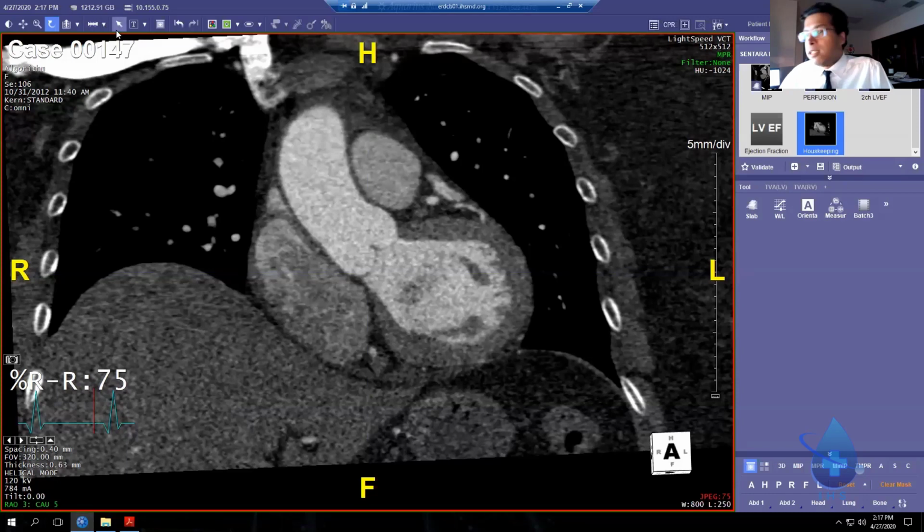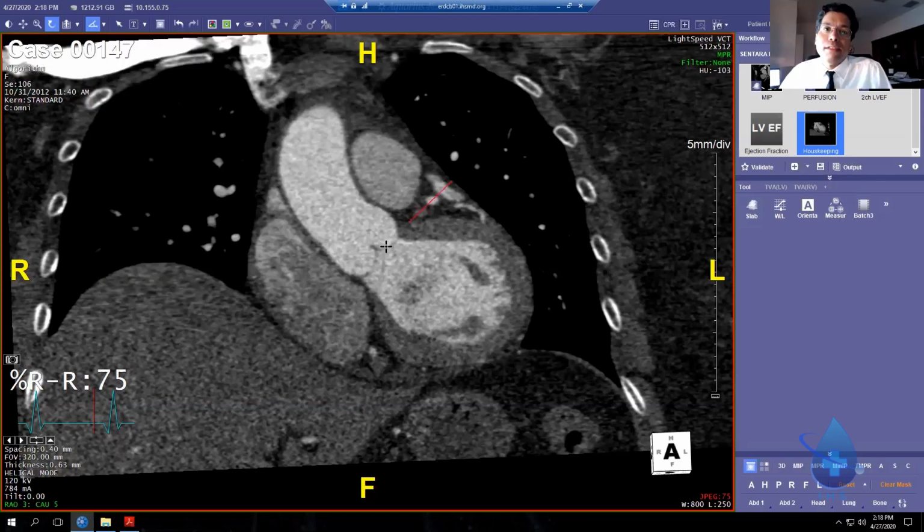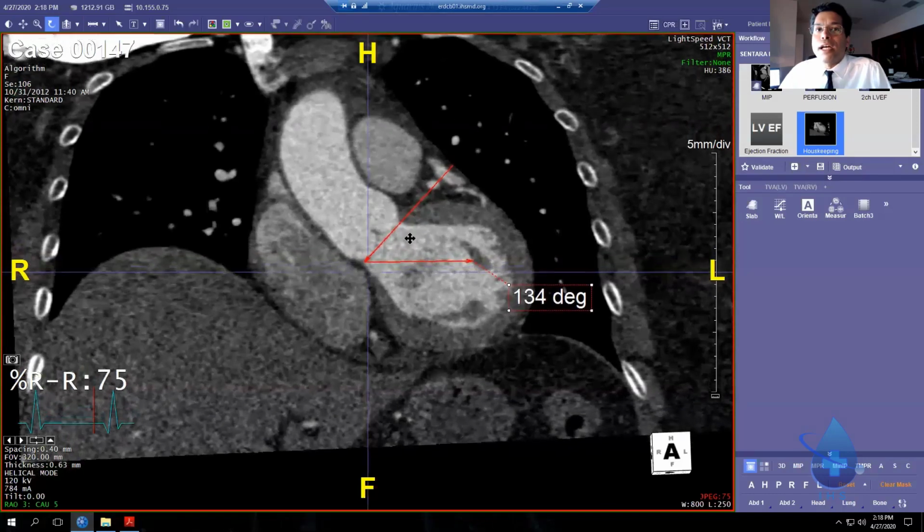You guys do transesophageal echoes. When you put the probe in the patient's mouth up here, where this H is, you put the probe in and you push the probe down the esophagus. And when you get to the aortic valve, can you see the aortic valve on TEE very well at 0 degrees? No, you can't. You usually have to switch to what degree? 30 or 45. Yeah, so why is that? Here's the reason. The angle of that aortic valve is about 30 or 45 degrees off the horizontal.